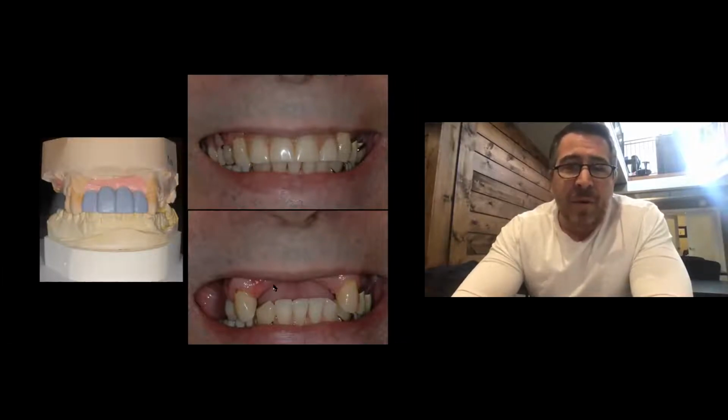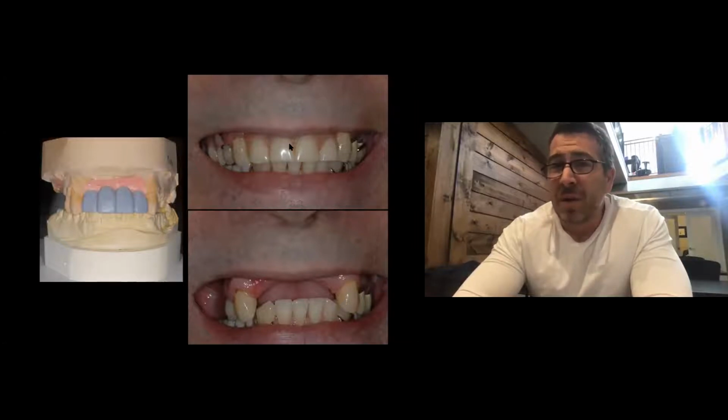So at the end of the first round of grafting, the patient's looking at their prosthetic, and the prosthetic is actually telling you that you don't actually have your soft tissue in the right position to give you the teeth that you need, because the pink on the acrylic is showing you that there's something missing.